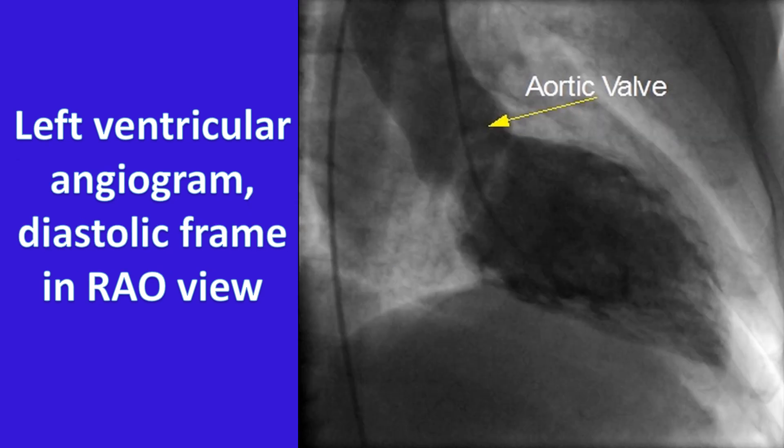The diastolic frame of the left ventricular angiogram shows trabecular pattern as negative shadows. The aortic valve in the closed position is seen as a thin negative shadow at the base of the sinus of Valsalva.